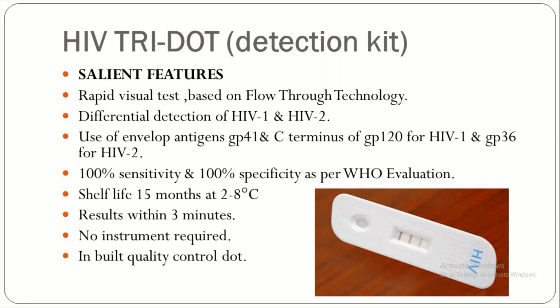So you can visualize the results within 3 minutes. You can see whether you are positive to HIV-1 or 2 or negative. So no instrument is required again. Visually you can detect.